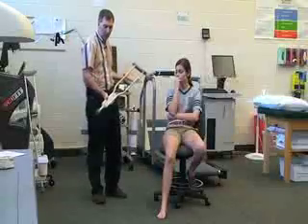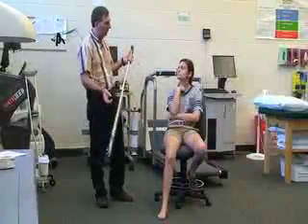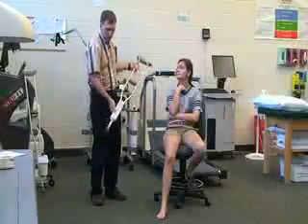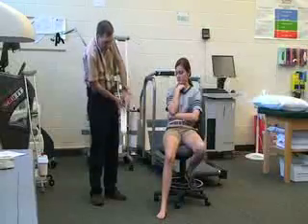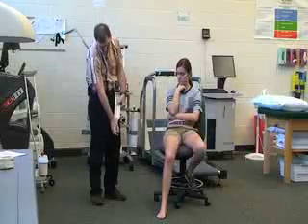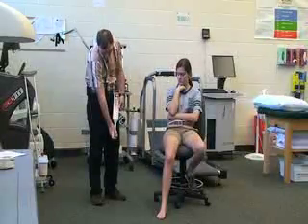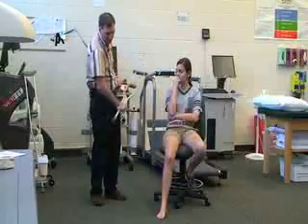For these aluminum crutches they do have the height settings on there, so you can ask the patient how tall she is. She's 5'7". This is currently set at 5'5", so all we need to do is push the button in, slide it down, turn it slightly, and then pull it down to 5'7". Make sure it locks before we test it.